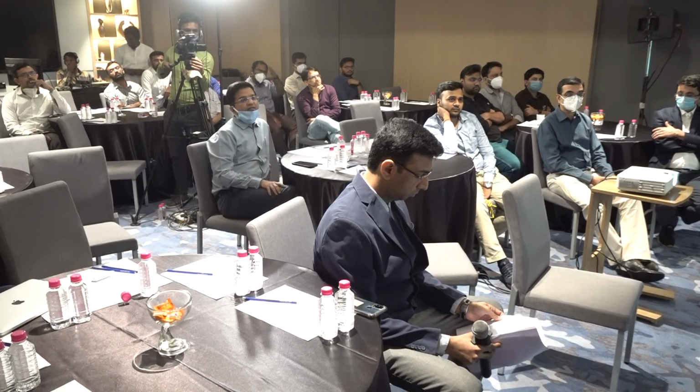Just one biopsy in the center, and then come out, because at least for documentation you've got a biopsy. Then you may talk to the patient and say, okay, it still looks suspicious, I think I'll resect it. My skills are good, I don't think you should have a problem. That will depend on an individual's endoscopy skill, what the patient's rapport with you is, how you are able to convince them. But you're right, I think it's a good idea to biopsy a lesion if you're not sure.